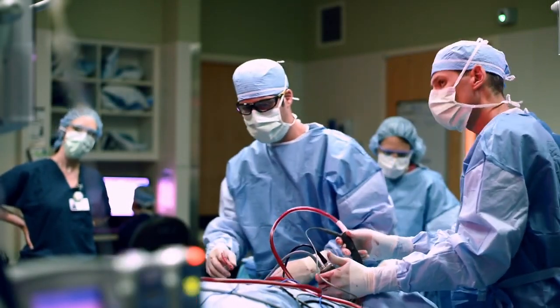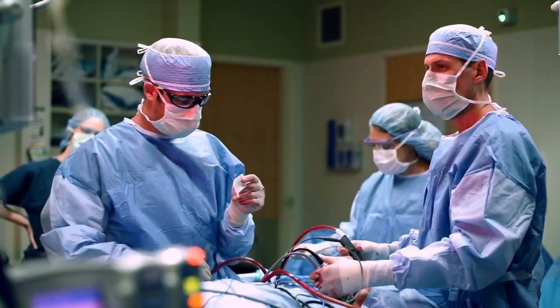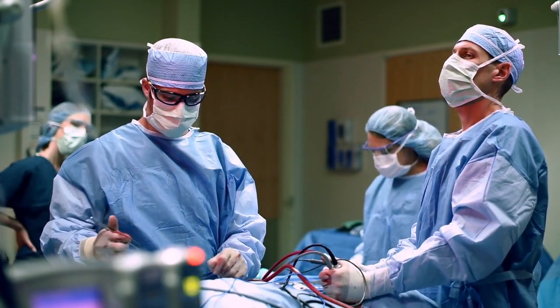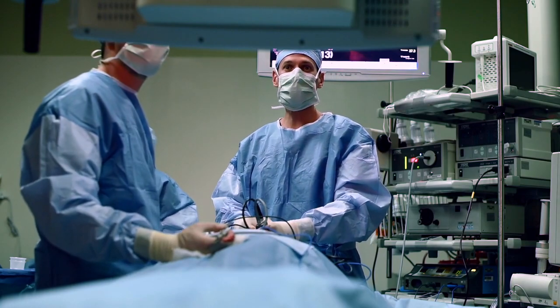VATS was probably first started about 20 years ago, and initially it was video-assisted thoracotomy, where you made a traditional incision and used a camera between the ribs to see some dark corners of the chest and hard-to-see spaces. Over the course of years, the incision size has decreased significantly to what we now call true VATS, meaning there's no direct visualization through the chest wall — everything we look at is on a video screen transmitted from the video camera.